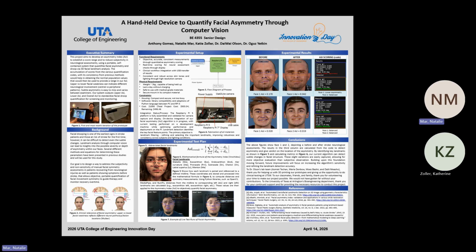So in conclusion, our results are calculated from the code to detect the asymmetry and give a verdict on the location of the asymmetry. And as Kitty mentioned, we're able to detect the subtle changes, but building upon the foundation moving forward, future improvements will be focusing more on the sensitivity and refining the landmark accuracy.